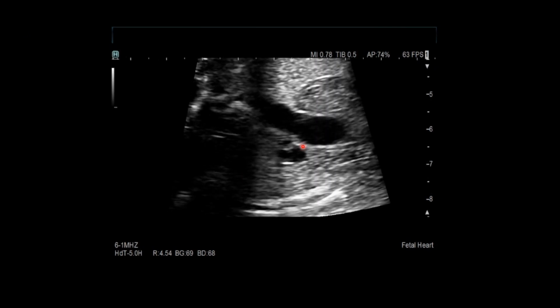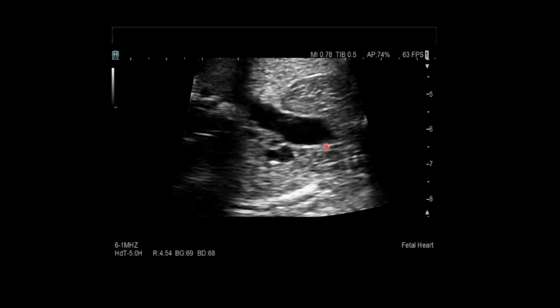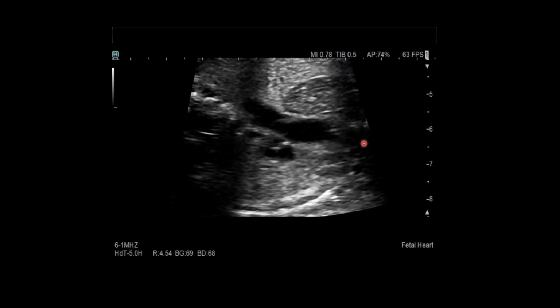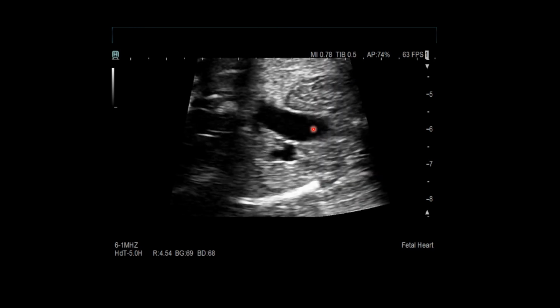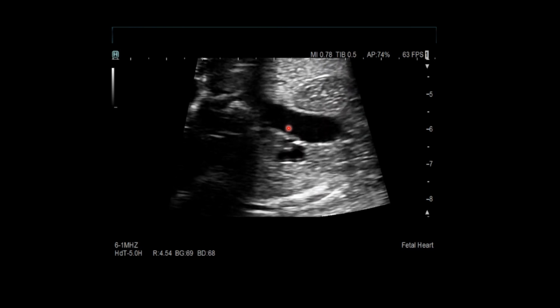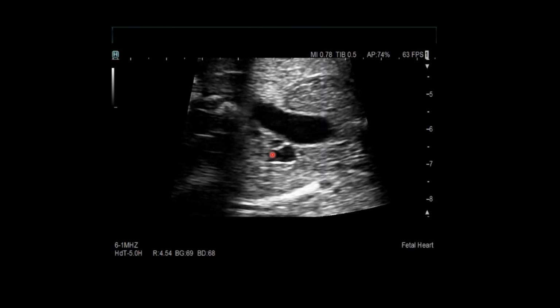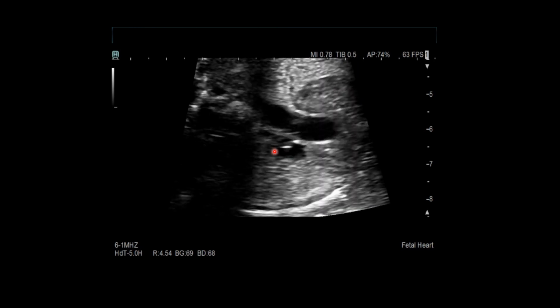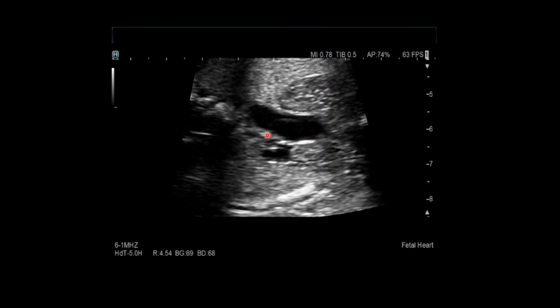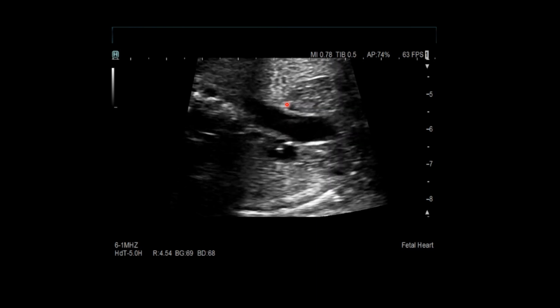Closer look at this, sweeping up even further up into the chest here at the level of the thymus gland. You can see a nice large thymus gland here in front of the heart, and this vessel again does not bifurcate, so it's likely that this is the aorta. Here is the SVC and what appears to be a dilated azygous vein draining into that SVC here, and then no obvious appearance of pulmonary artery branches.